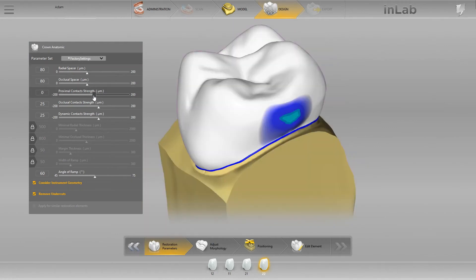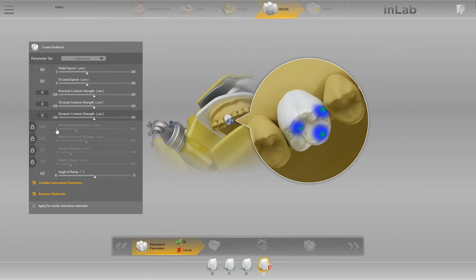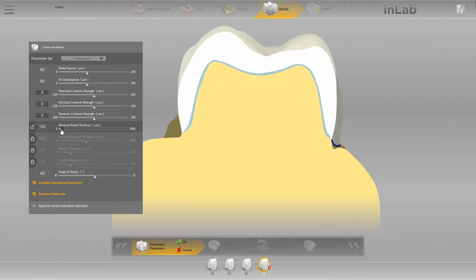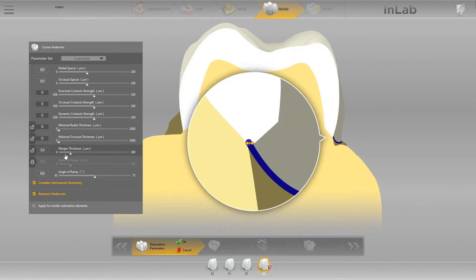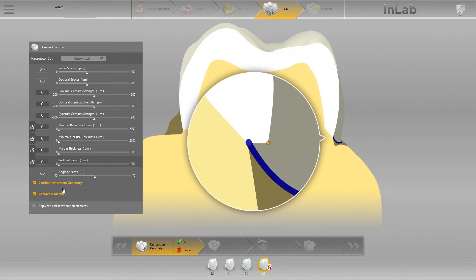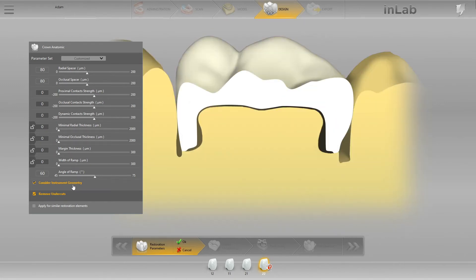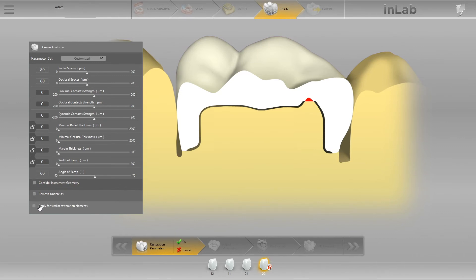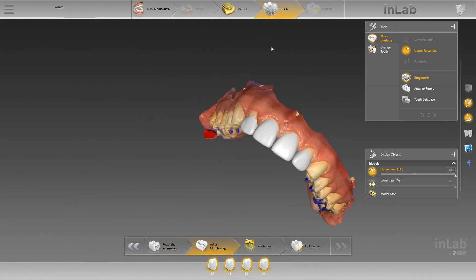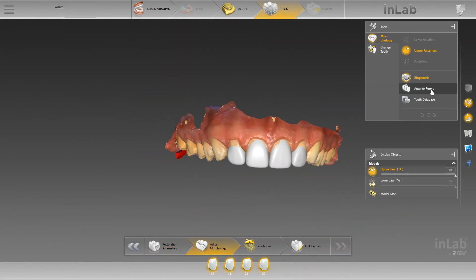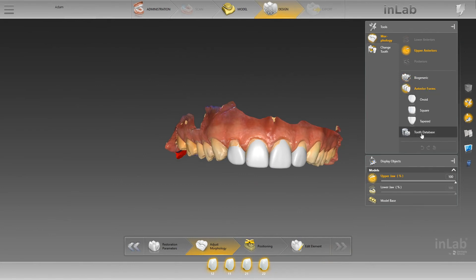This is the key part people often struggle with. We need to take all the contact strengths, all the thicknesses — everything down to zero, including the marginal thickness and the ramp thickness. I'm going to select 'Apply to other restorations', and I'm going to turn off 'Consider instrument geometry' and 'Remove undercuts' because I don't want those taken into account — I just want a pure buildup.